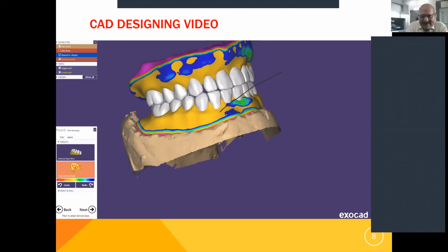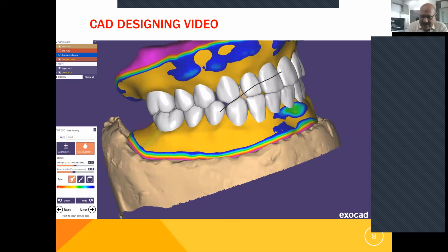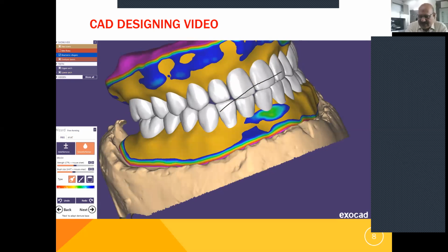What would be the lab cost of these milled dentures? It's approximately 11,000 for upper and lower. 11,000, upper and lower included. And will that include the check-in, try-in denture also? Yes, yes. You can take this trial. You can use that as a pre-op.